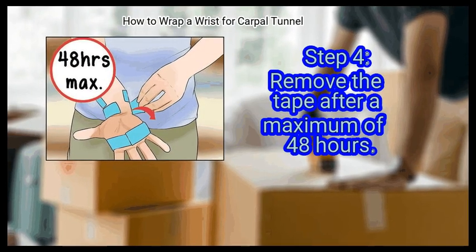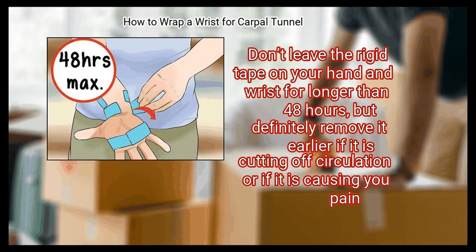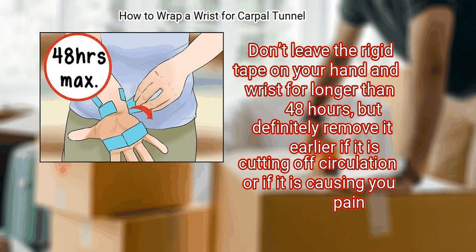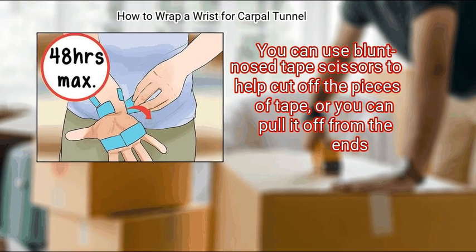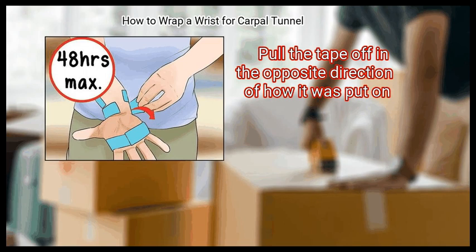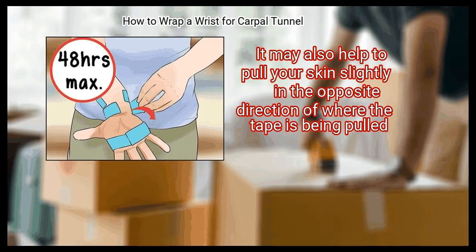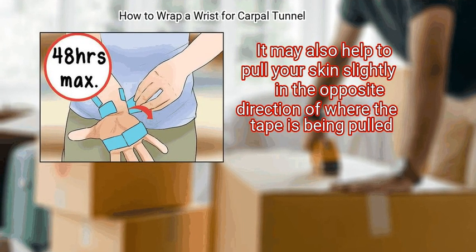Finally, remove the tape after a maximum of 48 hours. Don't leave the rigid tape on your hand and wrist for longer than 48 hours. But definitely remove it earlier if it is cutting off circulation or if it is causing you pain. You can use blunt-nosed tape scissors to help cut off the pieces of tape. Or you can pull it off from the ends. Pull the tape off in the opposite direction of how it was put on. It may also help to pull your skin slightly in the opposite direction of where the tape is being pulled.